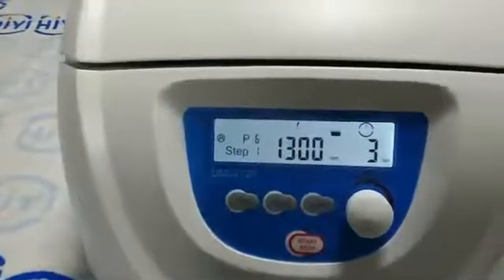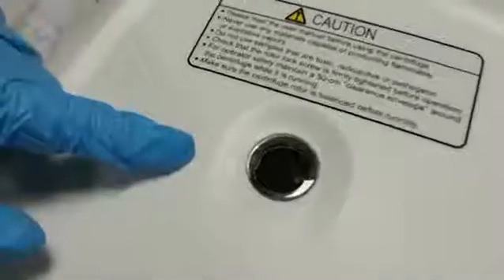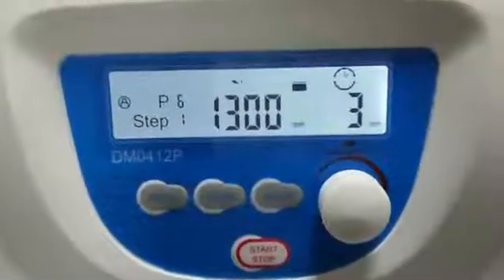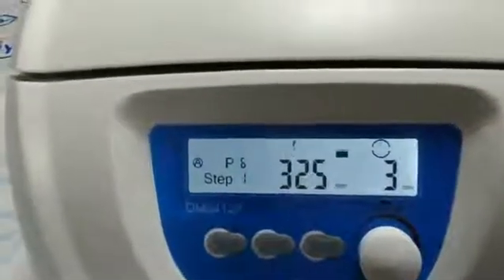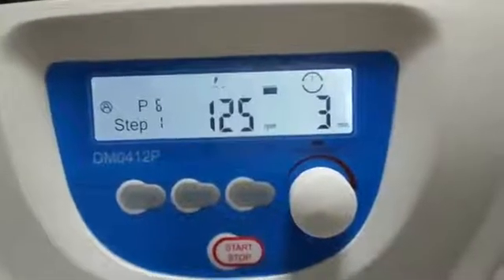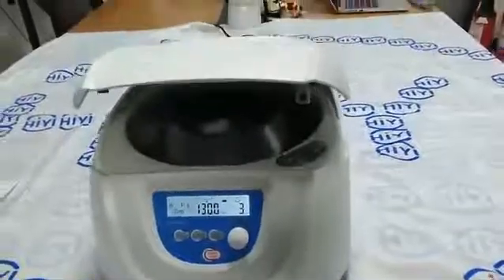We can see the speed is changing. Through the window we can see it spinning. Then we can see the speed is slowing down. Then we can see the door is open.